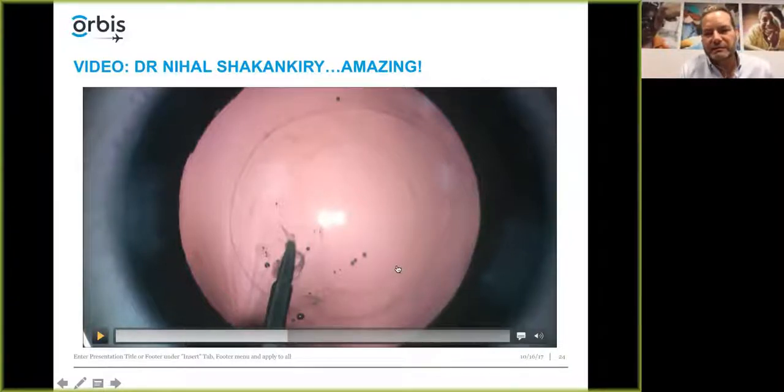The anterior capsulotomy is a perfectly nice round capsulotomy. She's made it probably about 5 millimeters in diameter. And since she's going to be putting the lens in after this is open, she's keeping the posterior capsule opening smaller. That gives her a nice area where she can put the lens implant in without catching the edge of this posterior capsule, because it is thin, and that's one of the downsides of potentially doing this technique, is that you can tear it and then have to fixate in the sulcus, potentially with optic capture posteriorly, but still your haptics might have to go in the sulcus. But here, she's keeping it small so that she can get her haptics in the bag, and I like that.